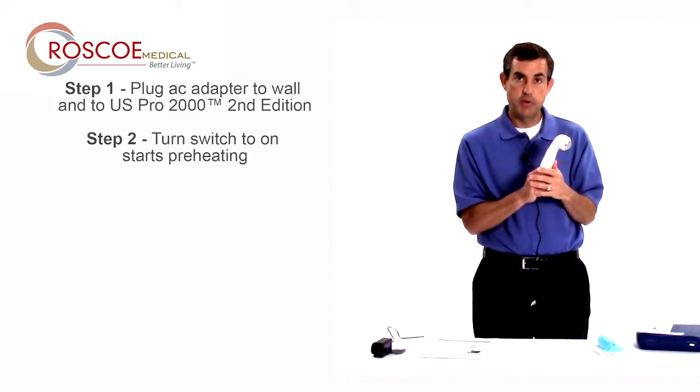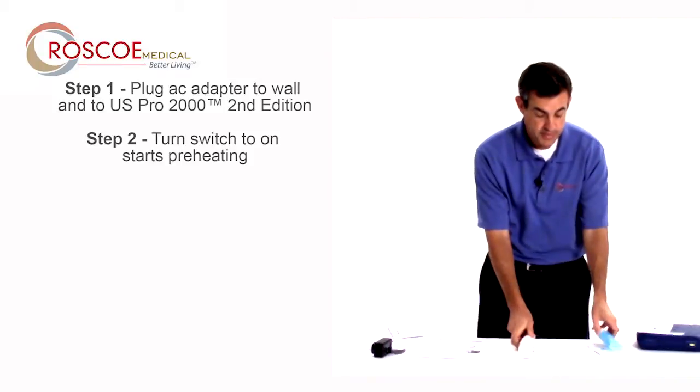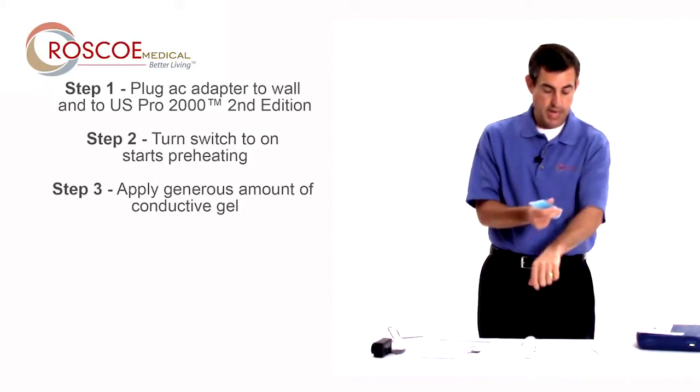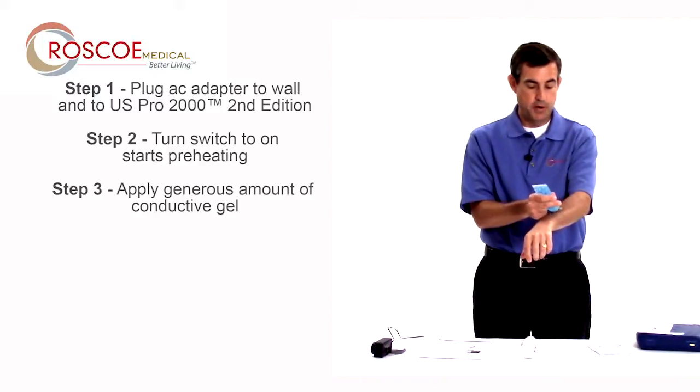So let's say I wait for three minutes. I take plenty of ultrasound gel — a big gob of it in the treatment area. I'm going to say it's on my forearm. Big gob of it.